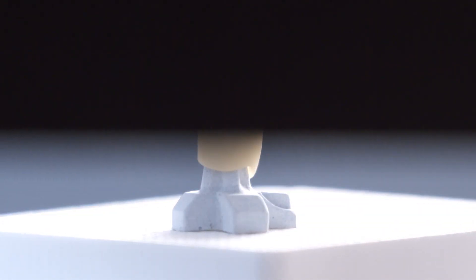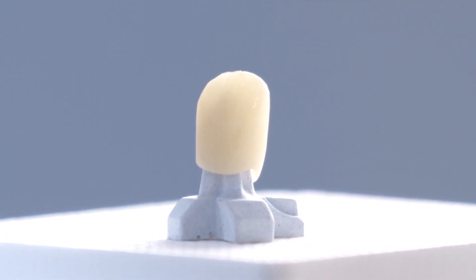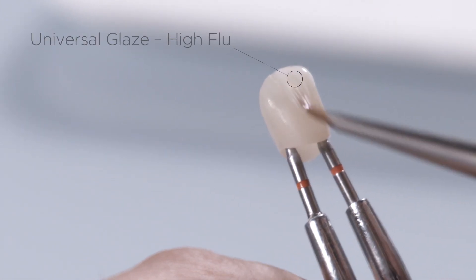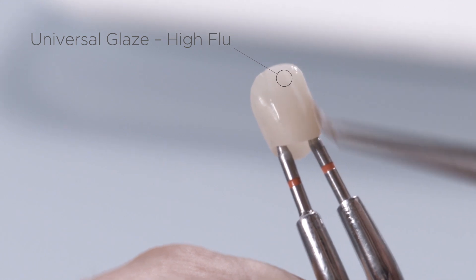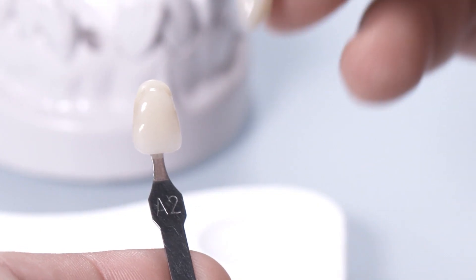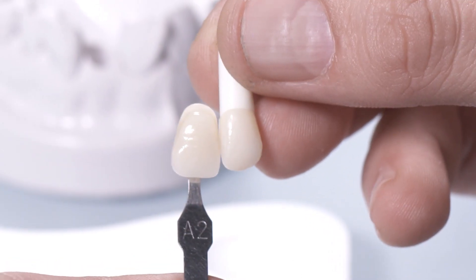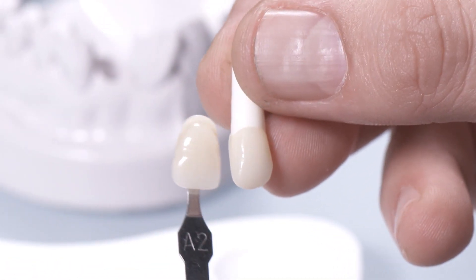After stain firing, add HIFLU Universal Overglaze to the monolithic restoration. The final shade check against the shade tab confirms the quick and easy shade reproduction with appealing aesthetics.